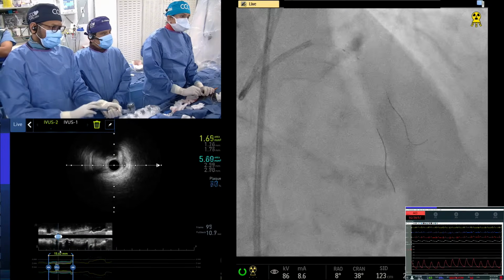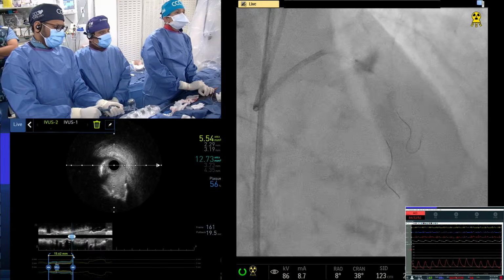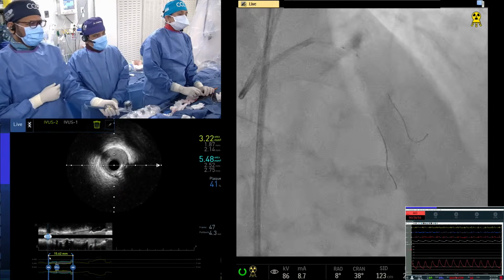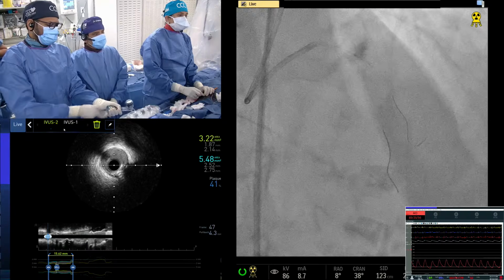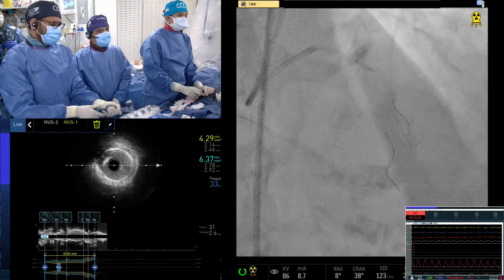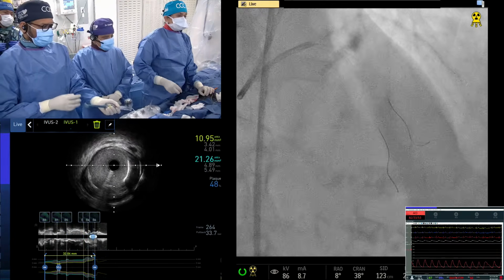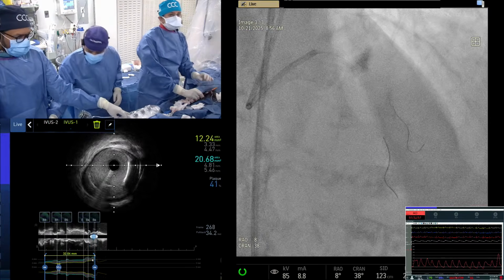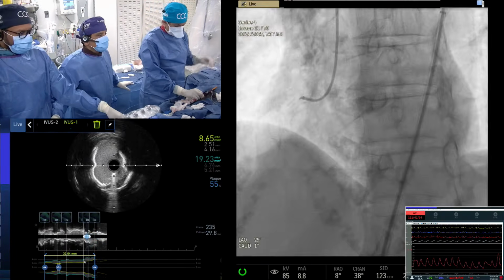Go up here. Okay, so you want 3.0. Yeah. So let's try to understand in the earlier caudal view how bad is the distal left main and what is the ostial circumflex. Go up here. Now you have to stent across. Yep. Okay, down. Good. Do you want to take a caudal view picture? No, we have it already. Okay. I take this one out meanwhile.